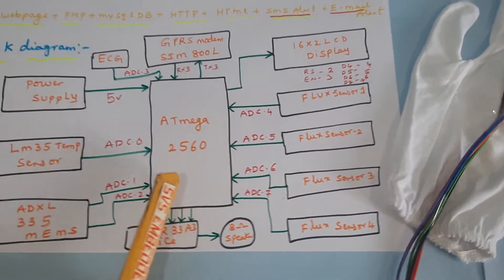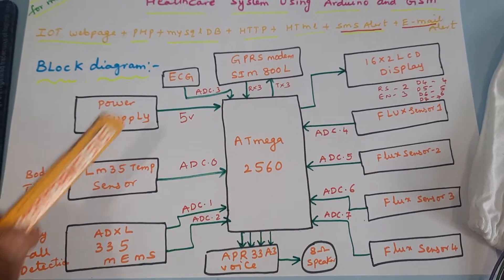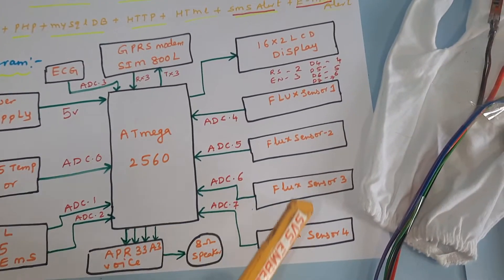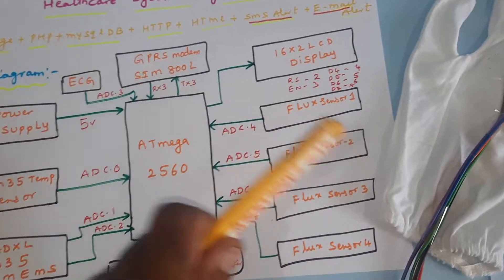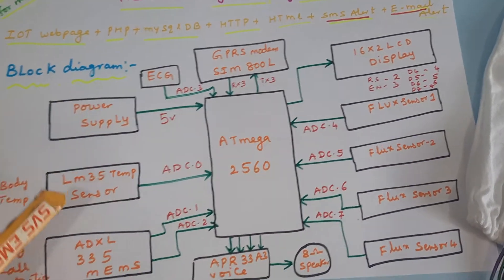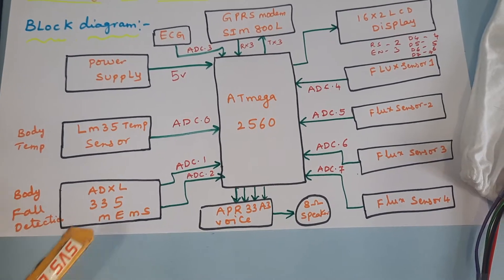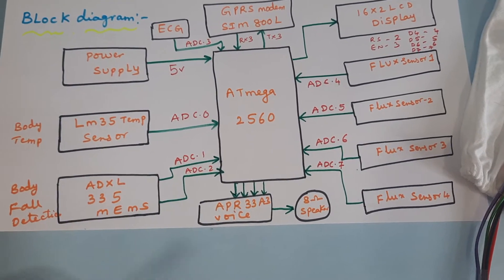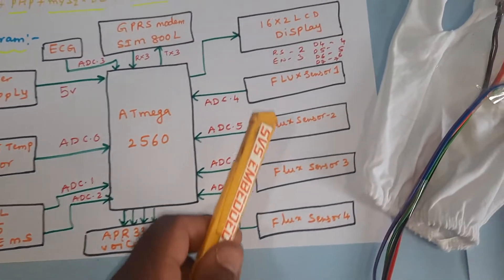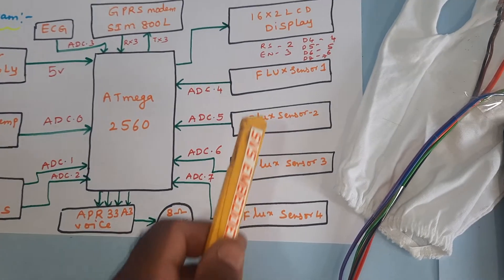We are using the Arduino Mega 2560 control board and a total of seven sensors: an ECG sensor, LM35 body temperature sensor, ADXL335 body fall detection sensor, and four flex sensors.